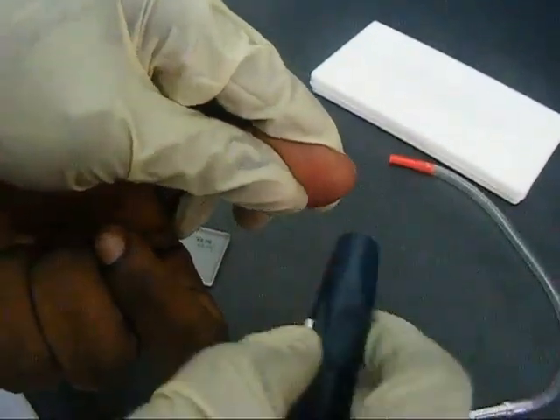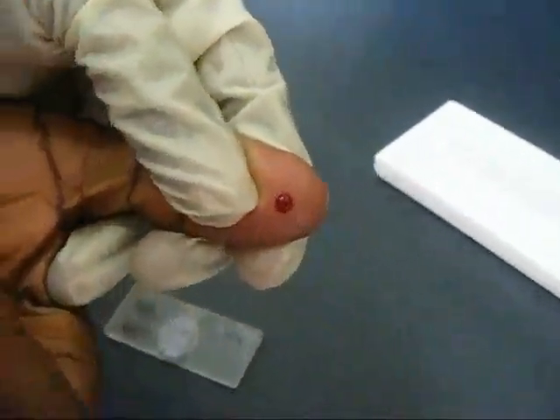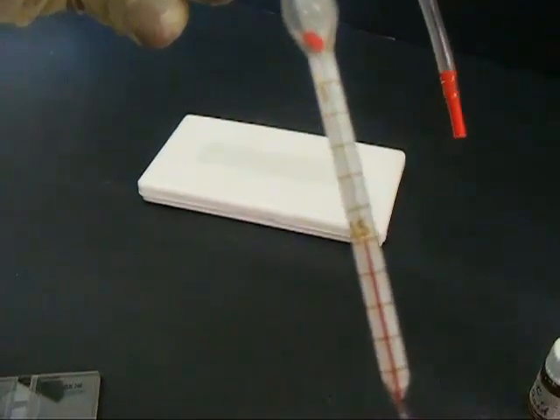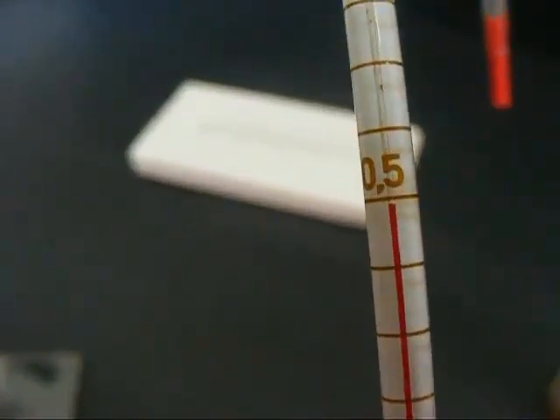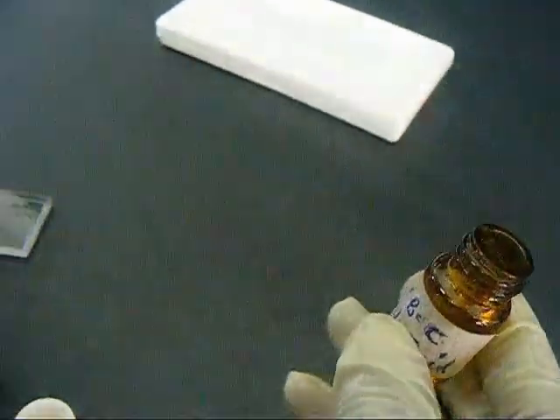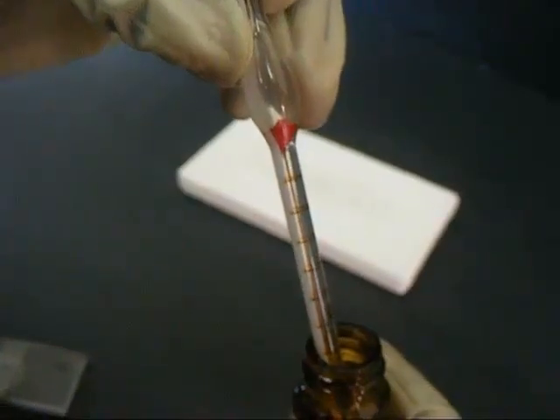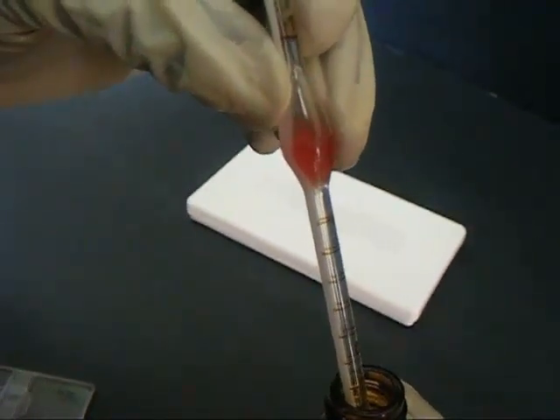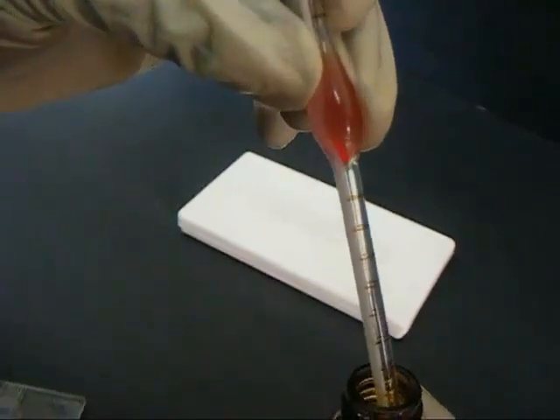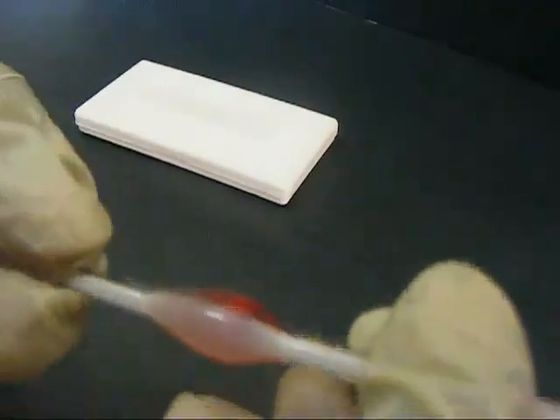The lancet is used to prick the tip of the thumb and the blood is pipetted with the red blood cell pipette and filled to the 0.5 mark. The pipetted blood is then diluted with the red blood cell diluting fluid and filled to the 101 mark.